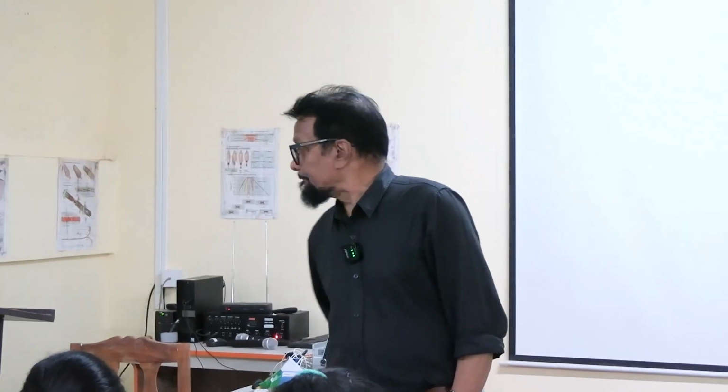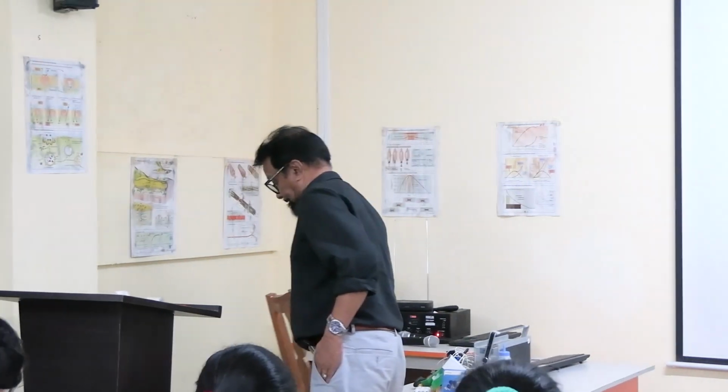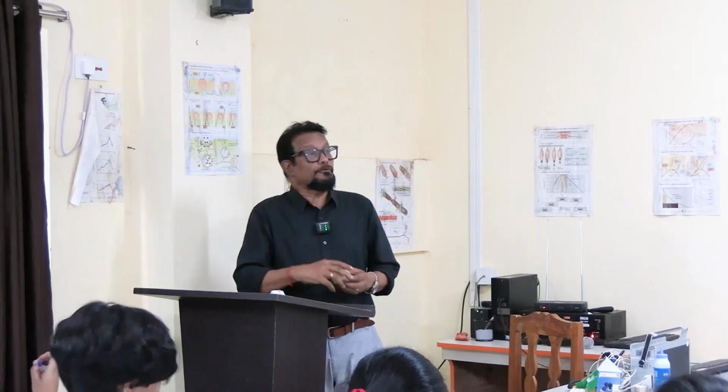What is the full form of ECG? Electrocardiography. What is electrocardiography? Electrocardiography is a method, a procedure, a technique by which we record... what do we record? The electrical activity of the heart. Okay? So this is known as electrocardiography.